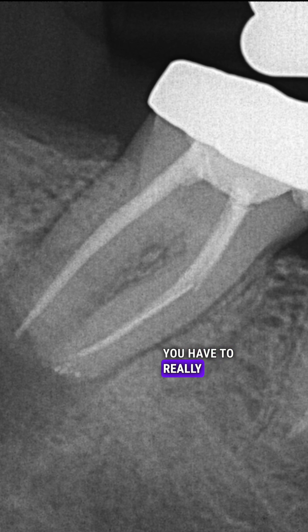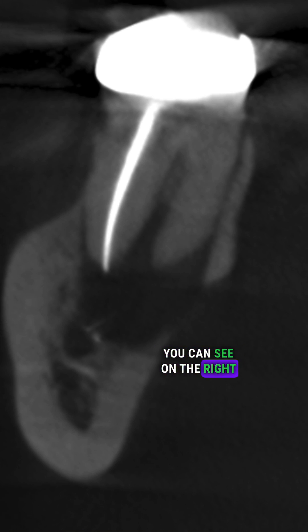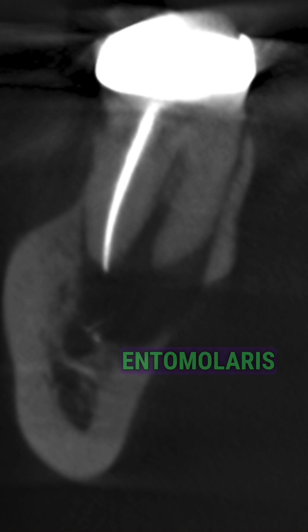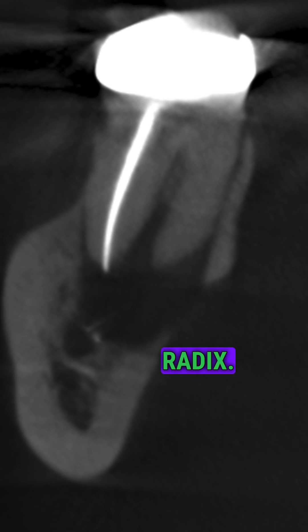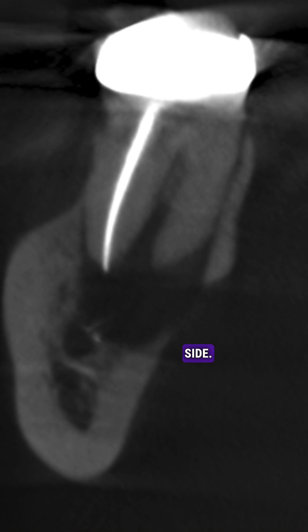You have to really have the 3D imaging in order to really visualize and diagnose this. And there you are — you can see on the right side there's no root filling. That is the radix. You can see it; it's on the lingual side. That's what the entomolaris represents. The lesion is right around the apex of that radix, and you can see cortical perforation of the plate on the lingual side.